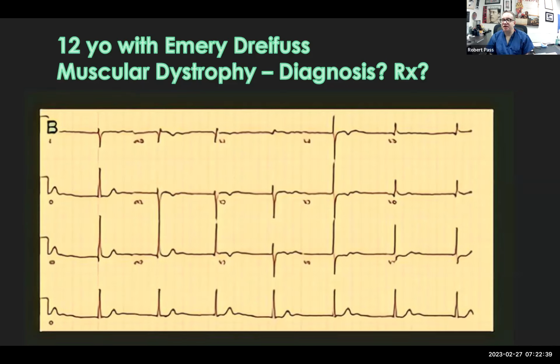Interestingly, when you do a 3D electroanatomical map, you basically identify scar throughout the atrium, and there are beautiful pictures. If you happen to listen to my podcast about 3 weeks ago, we talked about atrial standstill, and there are some nice images, and the link is in the show notes to that podcast.